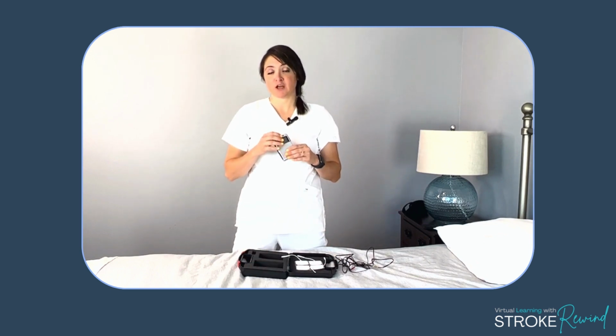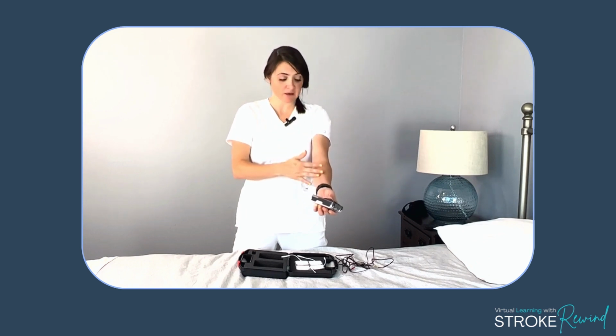One more thing. On the next slide, we show a list of contraindications and precautions when using electrical stimulation. So you always want to get this cleared by your doctor. A contraindication means you absolutely should not be using an electrical stimulation or a TENS unit. For example, if you have a pacemaker, you're going to have to ask your doctor if you can even use this, and typically the answer is absolutely not, because it can mess with it. So those are the list of contraindications.